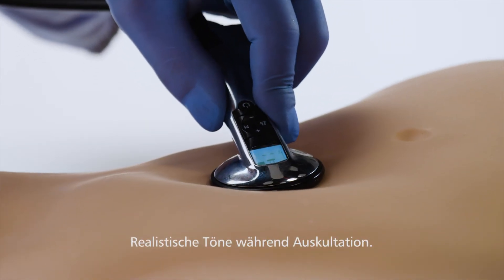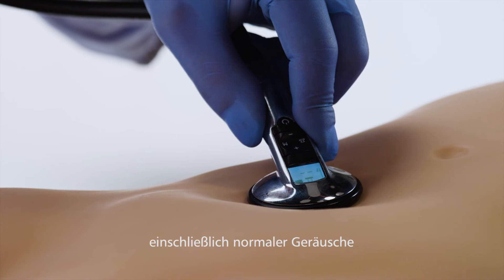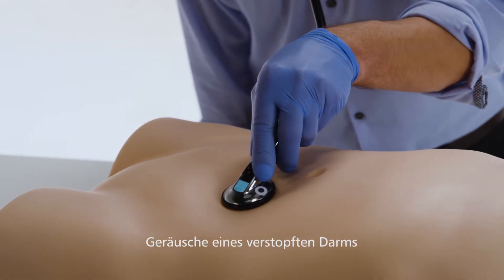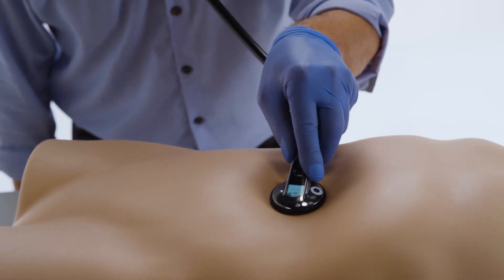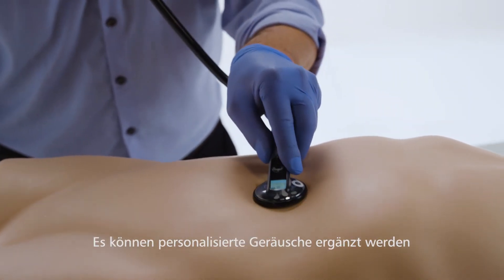Realistic sounds can be heard during auscultation, including normal, obstructed bowel or renal bruit. Personalised sounds can also be added.